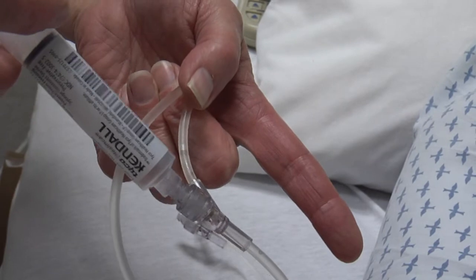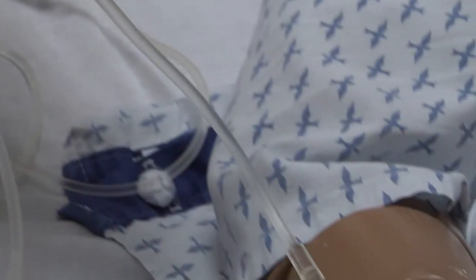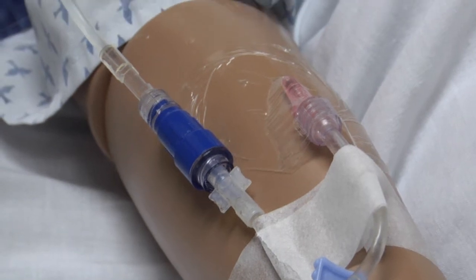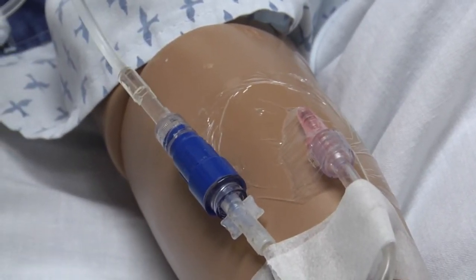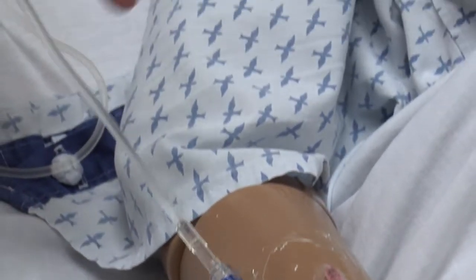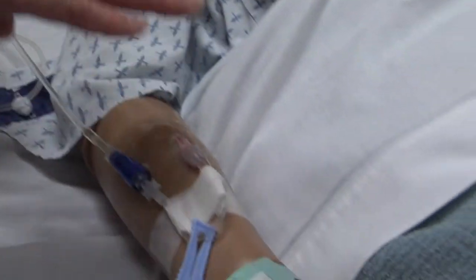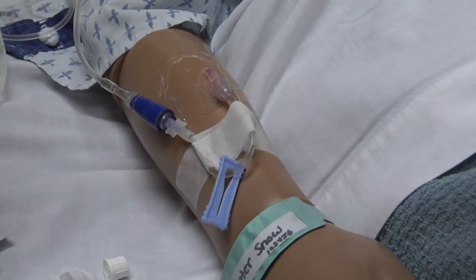If that's the case, then I could gently push down on the plunger and see if I could flush this IV by pushing some fluid in and through. The patient shouldn't feel any discomfort at this point, and it should flush very easily. If I could not push the fluid through, or if it was uncomfortable for the patient, then I would again discontinue this IV, take this IV out, and start it at a new site.